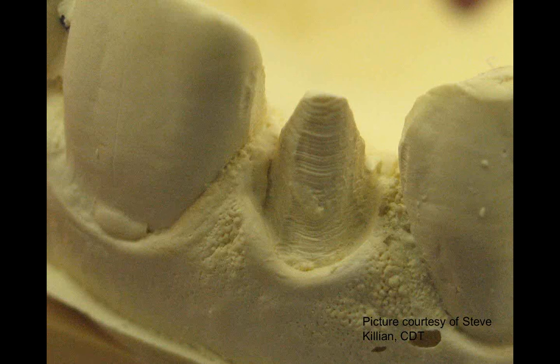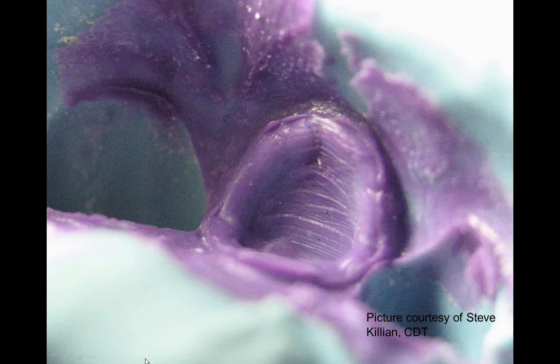So there's a little bit of methodology that needs to change there at the doctor's office. He did give you a nice area for a nice wide flat contact in that area, but I'm not sure that overcomes the other things that are going on with the impression.